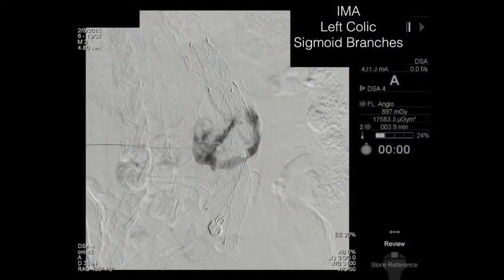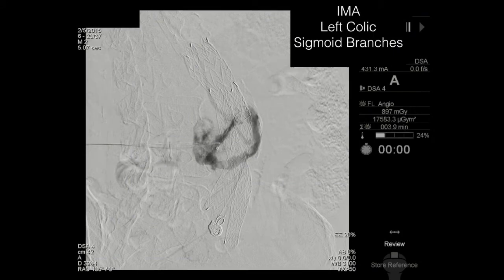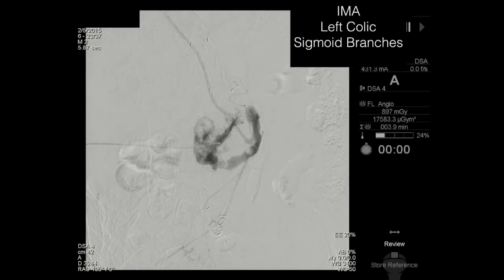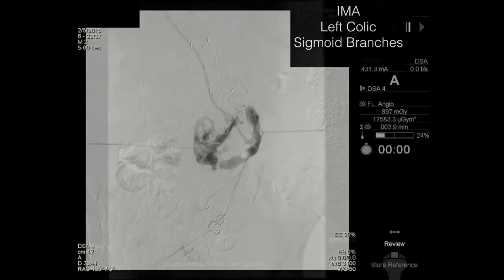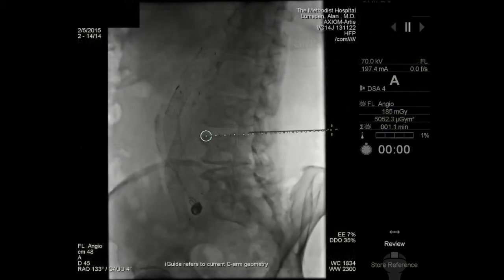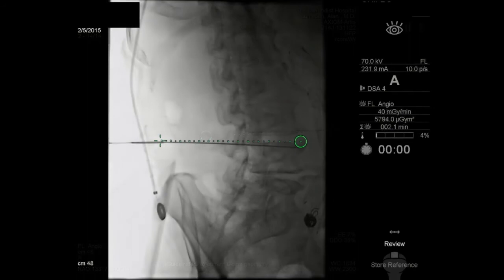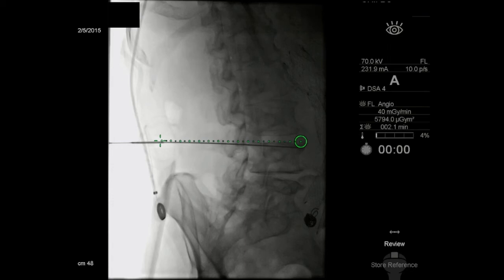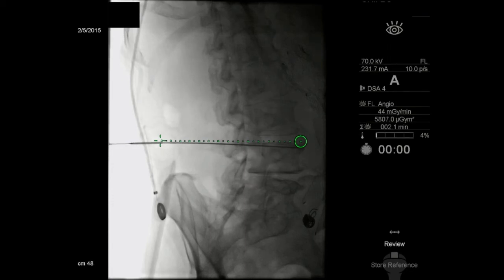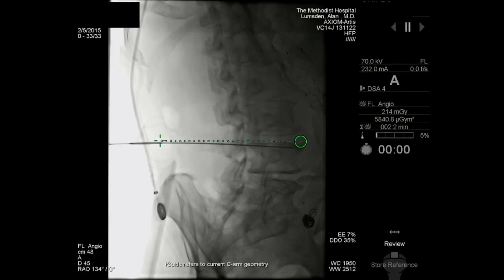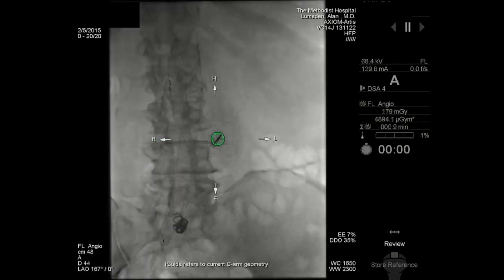This is a patient where we used translumbar guidance for an enlarging aneurysm. The needle has been introduced into the aneurysm sac, we've injected dye, and you can now see the left colic and sigmoid colon branches. Once you get access like this, you simply go ahead and work much like any other endovascular procedure. This is what the trajectory looks like as we push the needle down — we're slightly off at the apex, but otherwise this is a fairly safe way of gaining access into an aneurysm sac in a very controlled and stable manner.